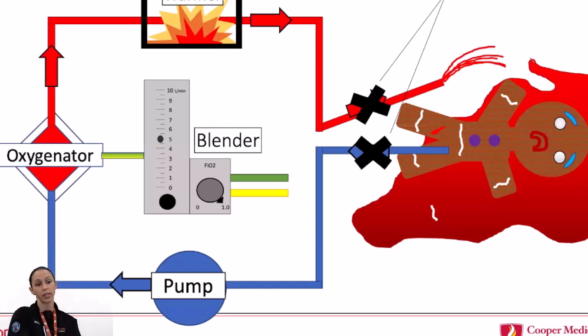Actually, I meant to say this, because two things came out of this. One, we had a debriefing in the moment because this was really traumatizing for everyone involved. I called his wife and told her what happened, and so we have an ECMO debriefing protocol where we debrief with the staff. Then we discuss it at our next ECMO meeting, and this is where the checklist came from.